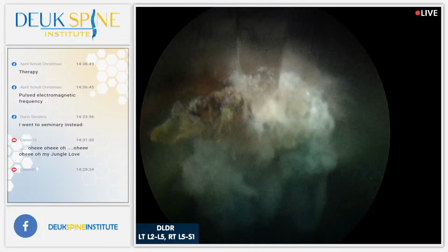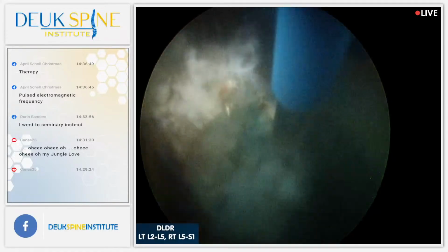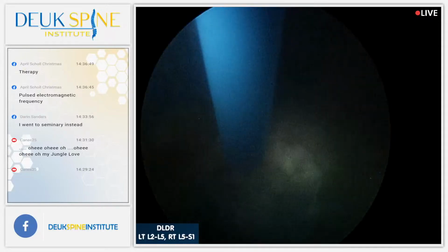Laser. Almost done. 5 minutes. But go ahead. I don't know if there's some information you have that you want to share. I'd be happy to hear it.